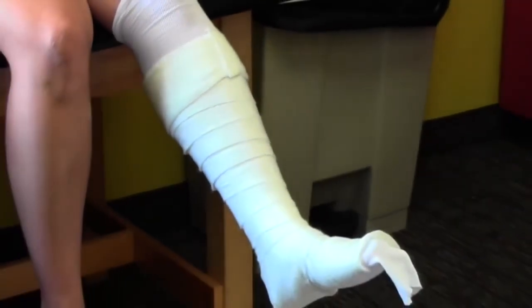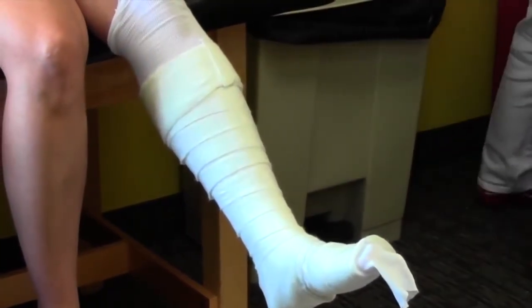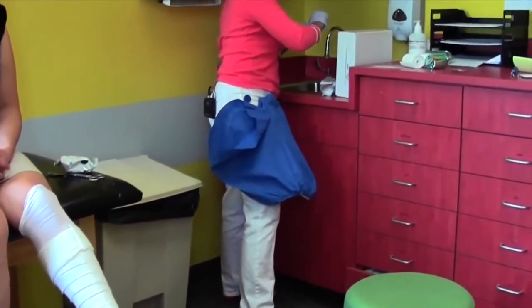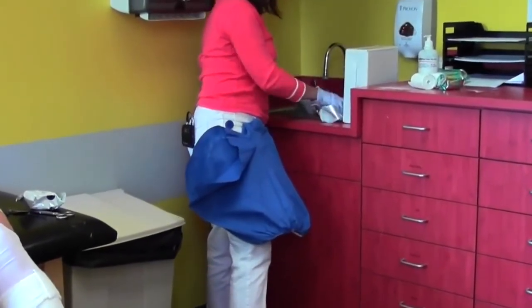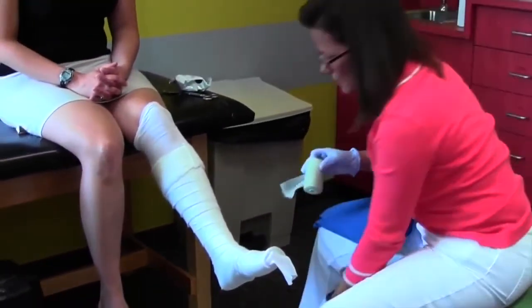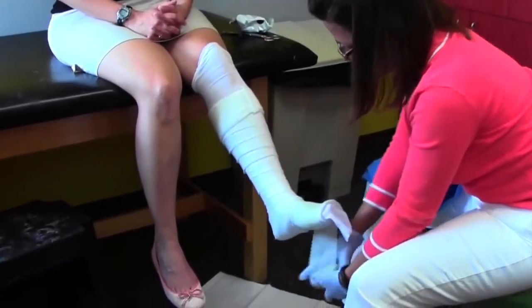Our victim has chosen a purple cast. So depending on how fast you are at putting on a cast, you can choose to do 1 layer at a time. The warmer the water you use, the faster the cast will set. The fiberglass sets quickly with warm water. It's a warmth dependent reaction, so the warmer it is, the faster it sets.